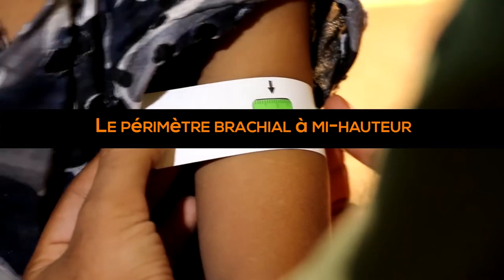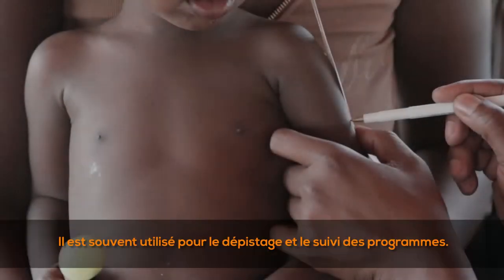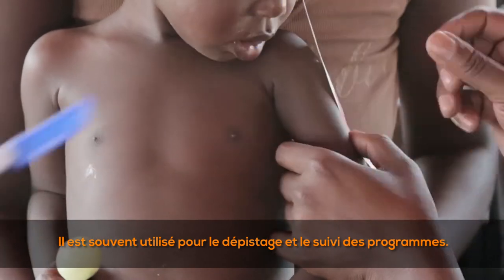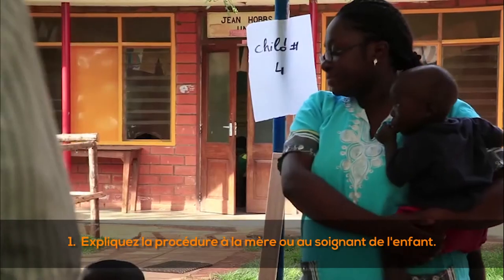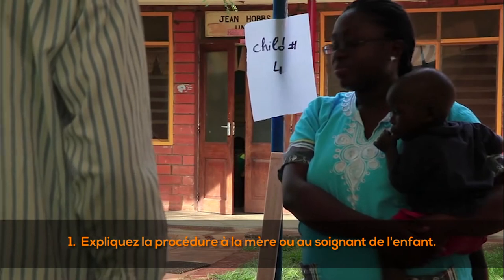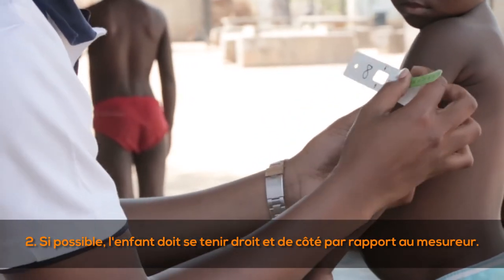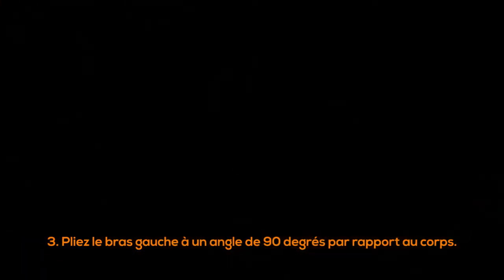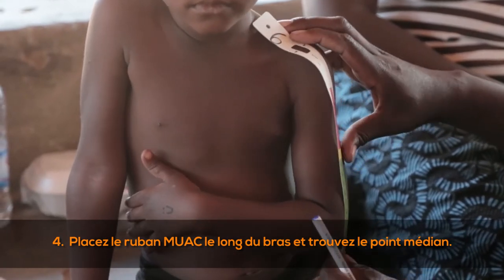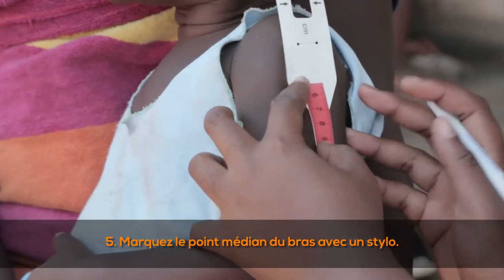MUAC — mid-upper arm circumference — measures the amount of soft tissue in the arm and reflects muscle density. It is often used for program monitoring and screening. Measurements are taken on the left arm and recorded to the nearest millimeter. (1) Explain the procedure to the child's mother or caregiver. (2) If possible, the child should stand straight and sideways to the measurer. (3) Bend the left arm at 90 degrees to the body, place the MUAC tape along the upper arm, and find the midpoint — between the tip of the shoulder and the elbow. (5) Mark the mid-upper arm point with a pen.